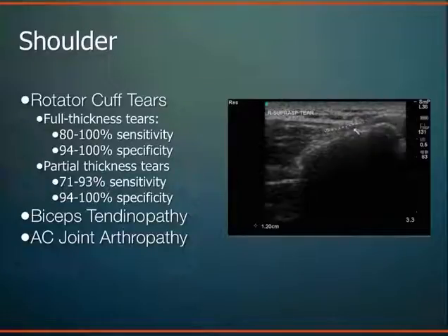So around the shoulder, this is an area that has been studied a lot because this is one area that is very common diagnosis and clinical complaint. Shoulder pain, shoulder impingement, rotator cuff tendonitis. A big reason why patients come into the clinic, and a big reason why we order a lot of MRIs. And so people are trying to find out, can we use ultrasound in the office, avoid MRIs, avoid healthcare costs, and is it a reliable modality to diagnose these rotator cuff tears or rotator cuff tendinopathies? And what we're finding with the literature is that it is very accurate and very reliable, and with sensitivity and specificity numbers that are quite remarkable in some cases. Very, very reliable modality.